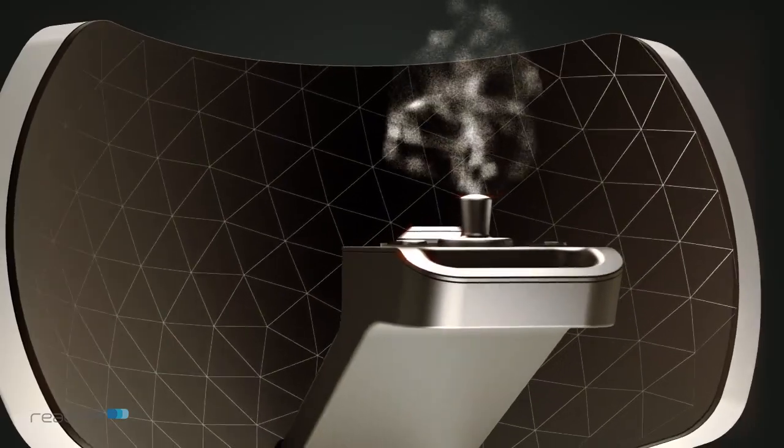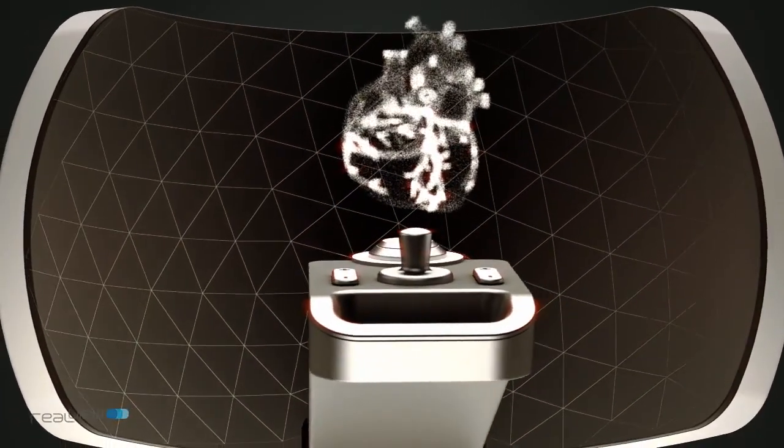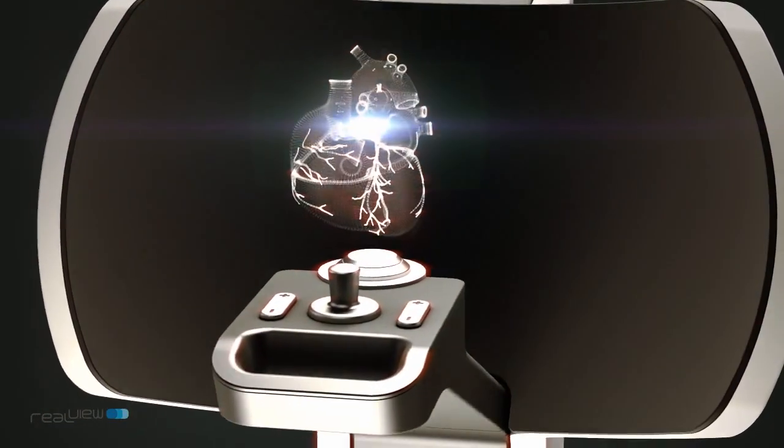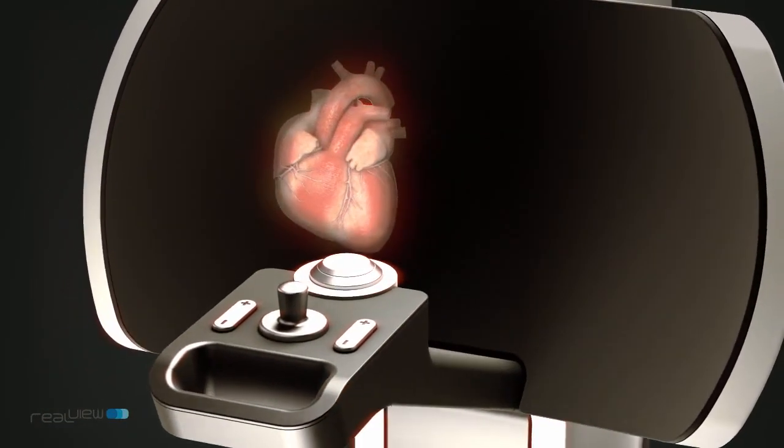We have overcome some of the greatest challenges in the field of digital holography. Unlike typical 3D stereoscopic solutions which project a mere illusion of an image, our technology accurately reconstructs actual points of light in mid-air.